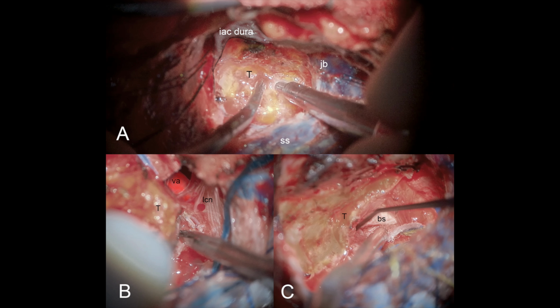In Panel A, note that the IAC dura remains intact. Keeping the canal closed at this stage provides structural support to the facial nerve while the intracranial portion of the tumor is removed. It is critical not to open the IAC dura until the very end, when only the canal portion of the tumor remains.